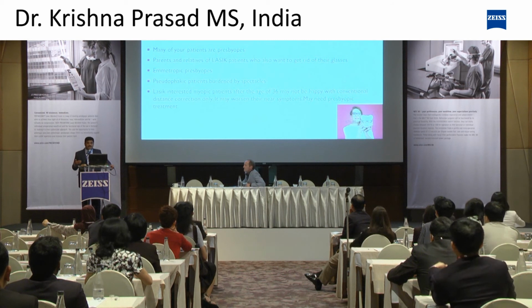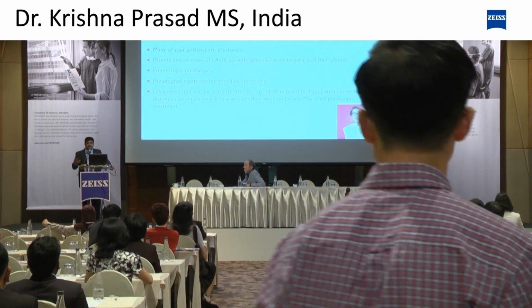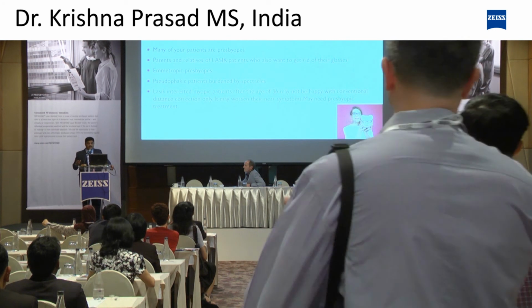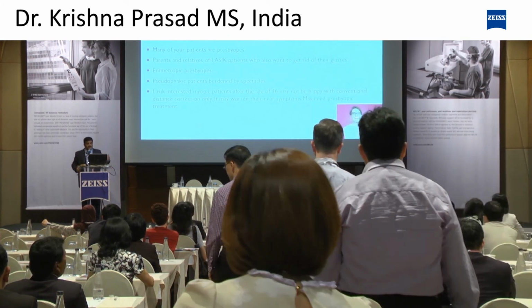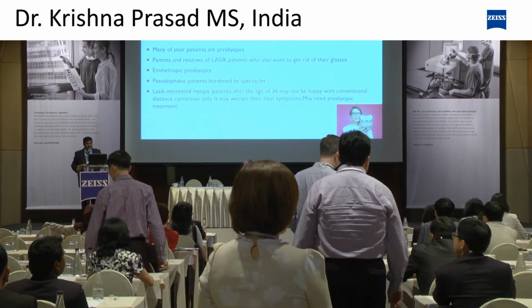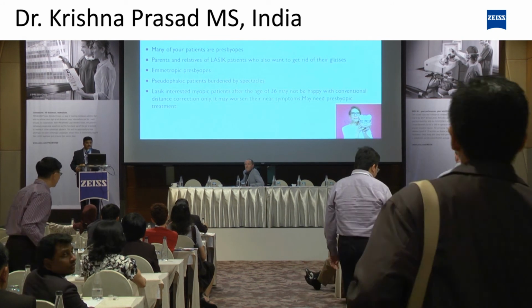Even a patient who might have already undergone IOL surgery, the pseudophakic patient, is also interested in getting rid of their glasses. Especially the myopic patient interested in LASIK after the age of 36 may not be happy with conventional distant vision correction only. It may worsen their near vision symptoms. So, these are the ideal patients to counsel for Presbyon.